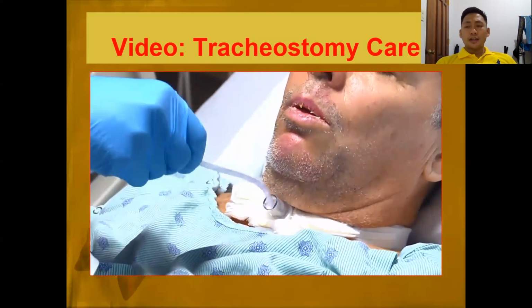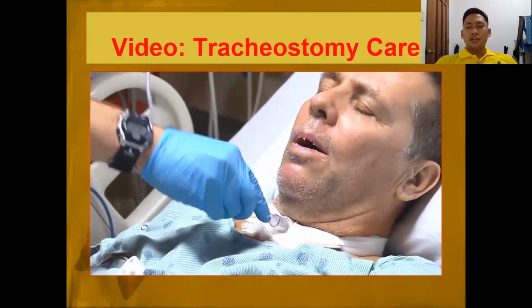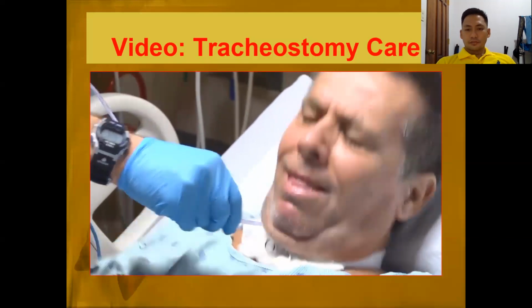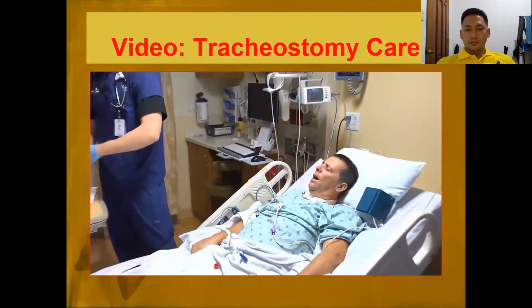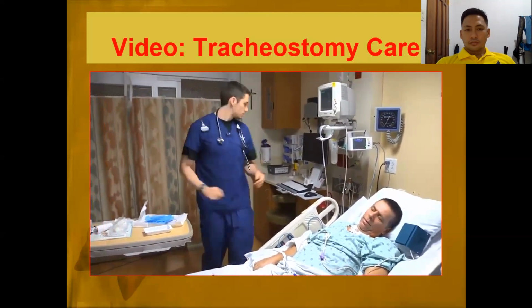Before you insert the suction catheter, make sure your thumb is off first. You do not cover the suction port yet. Okay. Before you take off your gloves, remove the soiled tracheostomy dressing and coil the suction catheter in your palm. Discard them inside your glove.